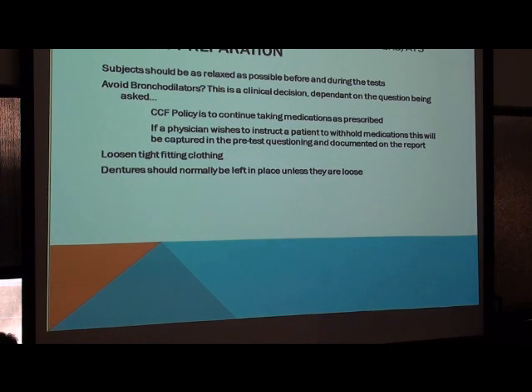And so in that setting, where they continue taking medications as prescribed, we give them an additional dose of a bronchodilator, really looking to see if it has improved. And with the current dose of bronchodilators, which we'll cover in just a moment, if they haven't responded, then the answer is they're doing pretty good. They probably are optimally treated.